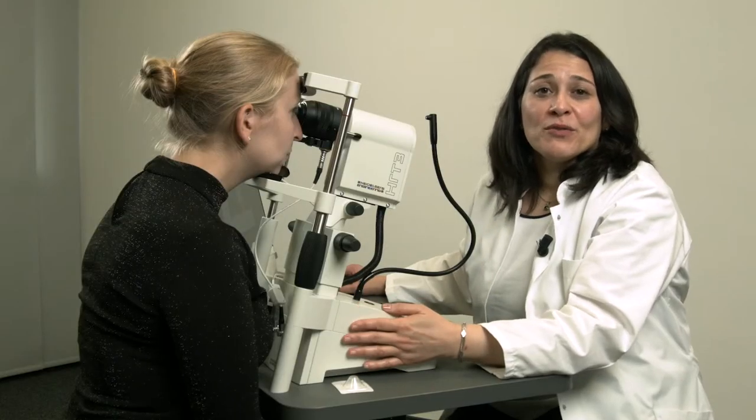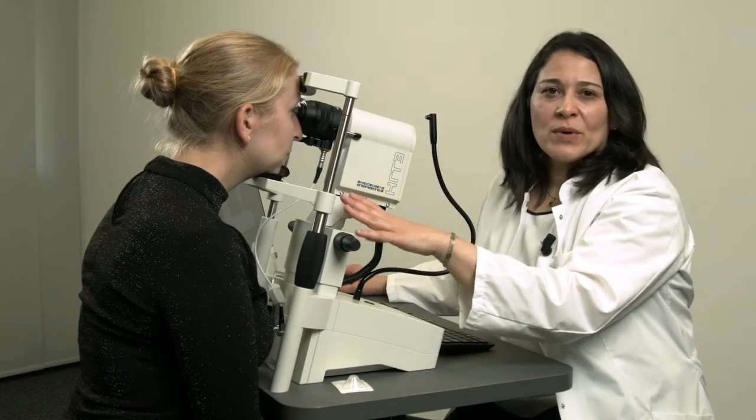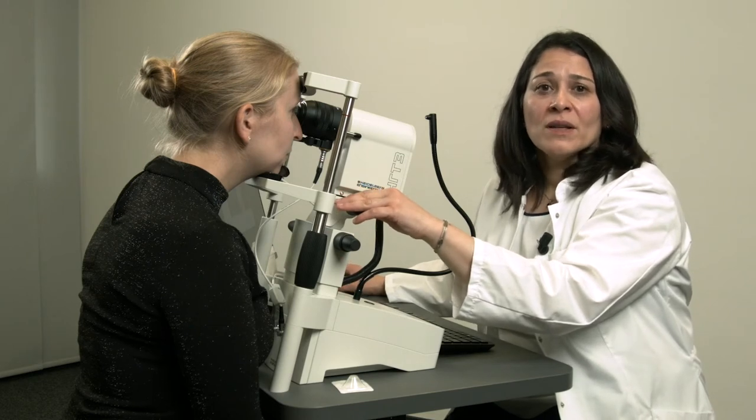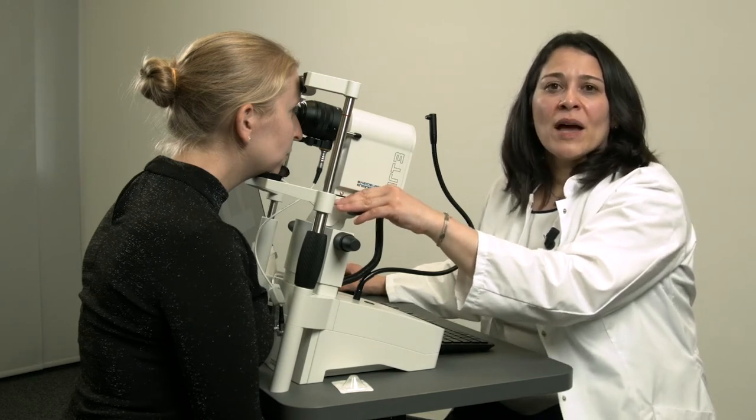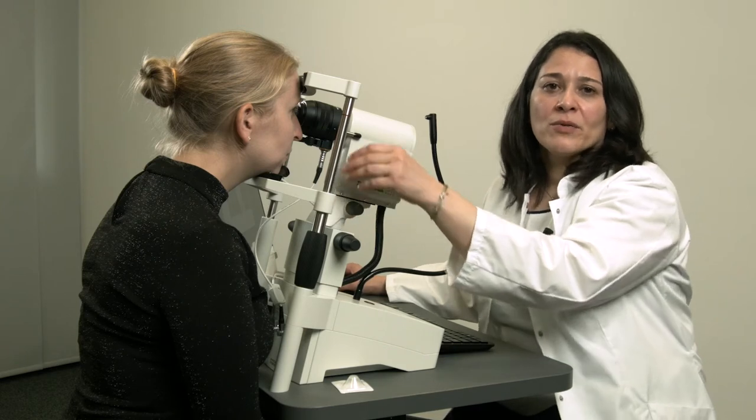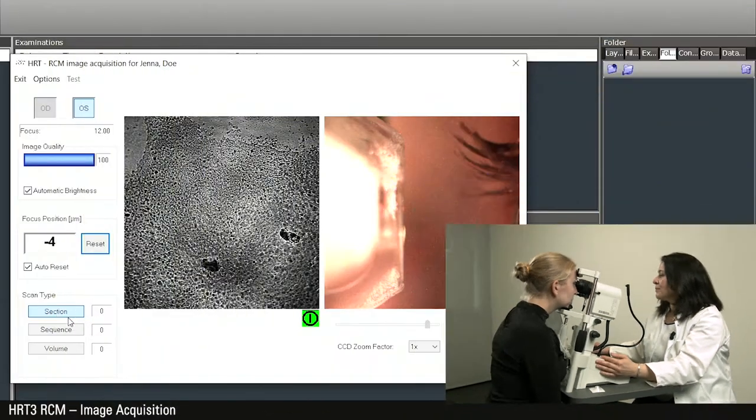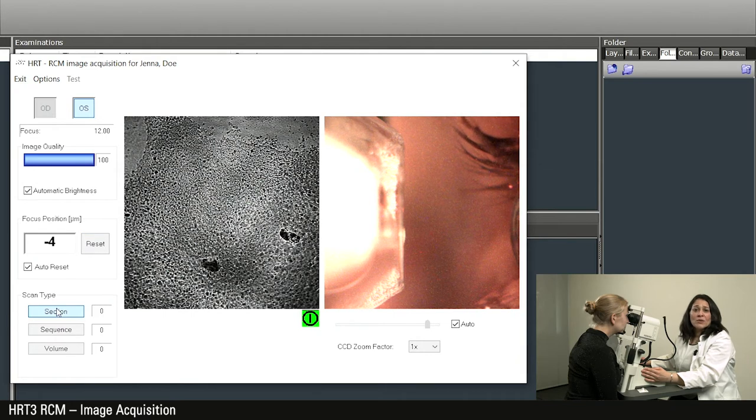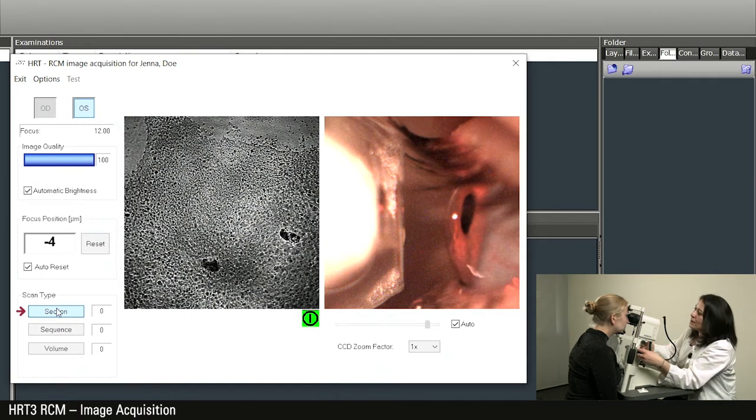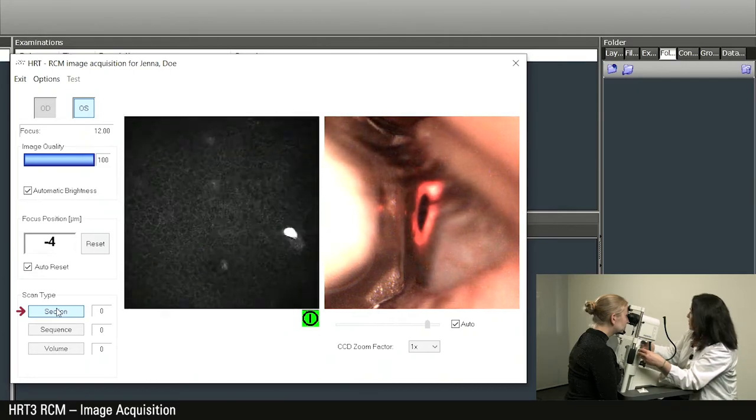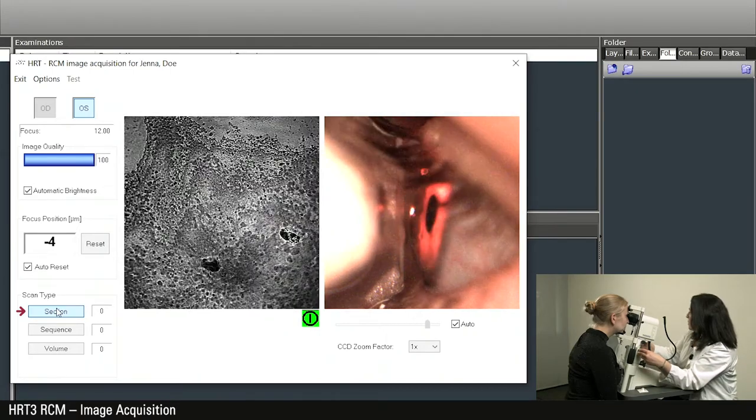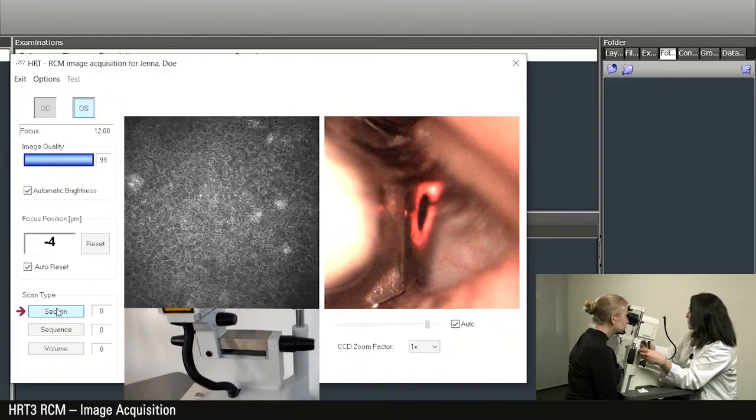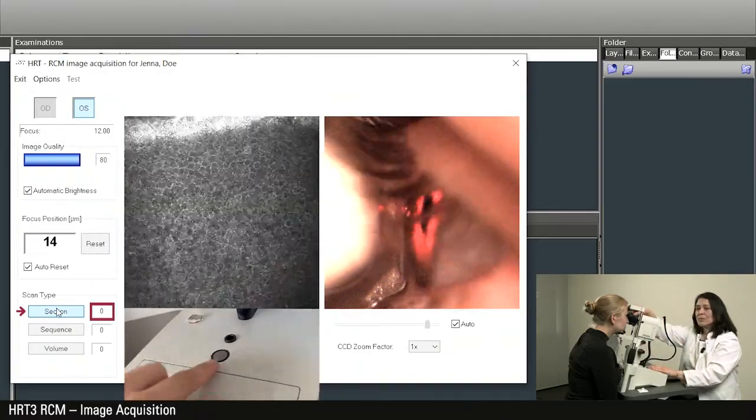Now I will show you different acquisition options. We have just went through the whole thickness of the cornea and now we will move back to the epithelium to have the focus position at zero micrometers to enable the different acquisition options. I start with the most commonly used mode, that is the option section. As you pass each corneal structure, you can now generate an image by pressing the acquisition button on the HRT housing. Take as many pictures and as often as you like.